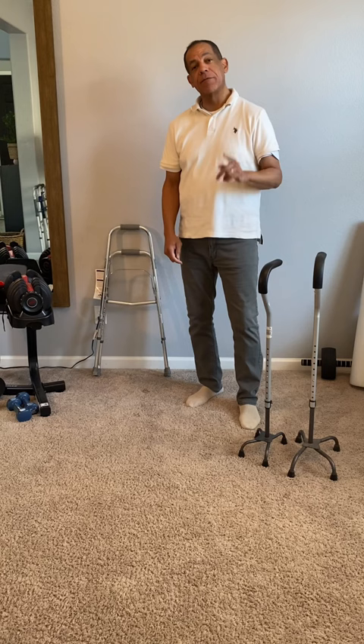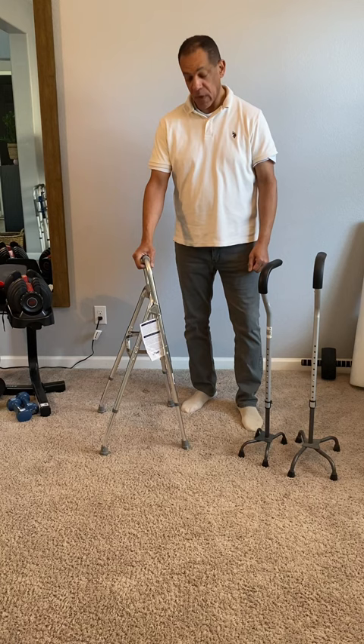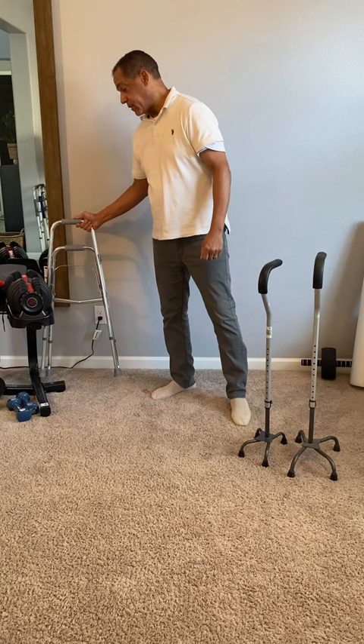But most people aren't as familiar with the Hemi Walker. The Hemi Walker can still be used with one hand to get around. It gives you a lot more stability, and it can stow a little bit easier than a quad cane can — just folding up, and you can place it behind something like so.